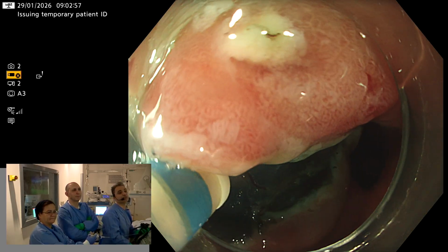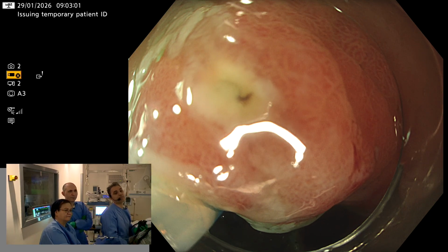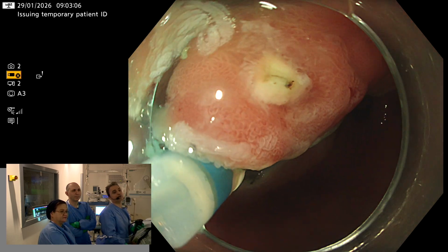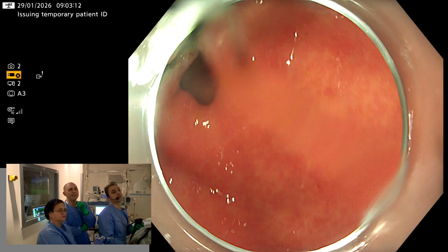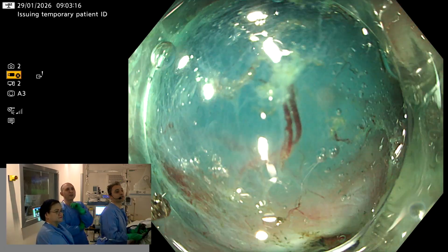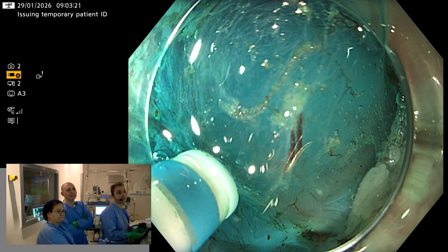While I am doing trimming, I ask my assistant to inject by the knife, please. Check, please. And I do a hole in the area, injection. As you see here, after the needle in, injection, the lesion is getting elevated. And you could see the submucosa very clearly, and you could dig with the cap beneath the mucosal side.